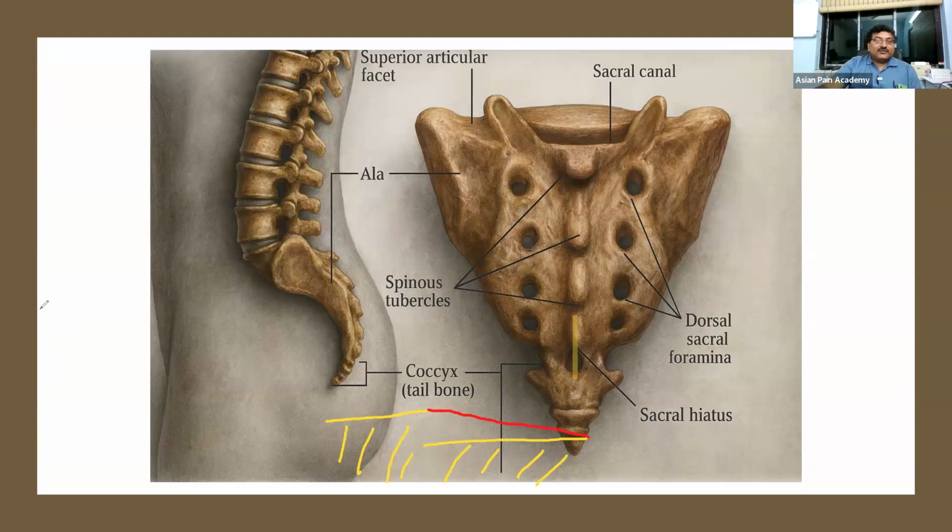Now, accidentally, you are not exactly at the center, but you are paramedian. For example, you can show like this. Instead of putting it here, you are putting it at this point, at the corner. In that case, it will look different. So let us draw how it will look. In that case, it will look like this. There is a projection and then it is a stick. So remember, whenever you are exactly at the center, it will look like this. Whenever we are over a corner, it will look like this.